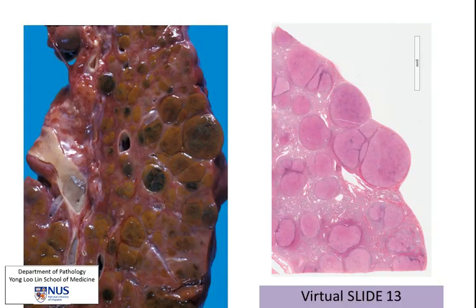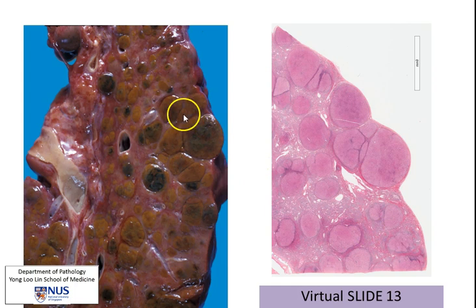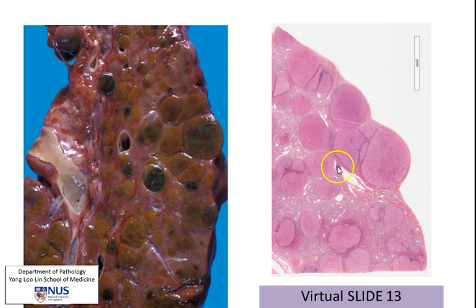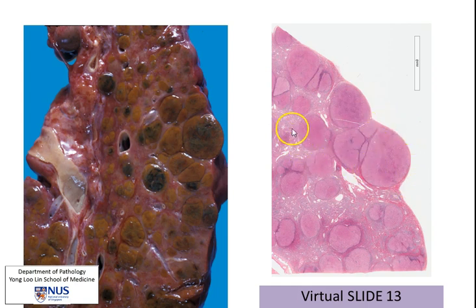We're going to have a look at the microscopic appearance. This is the cut surface. You can see the nodularity, and at very low power you can see the nodules of regenerating hepatocytes separated by fibrous septa.